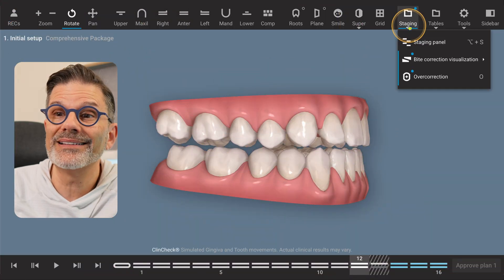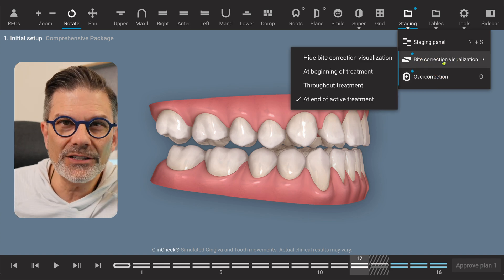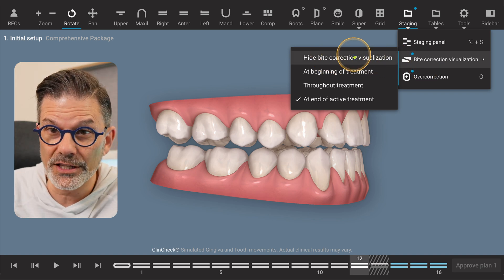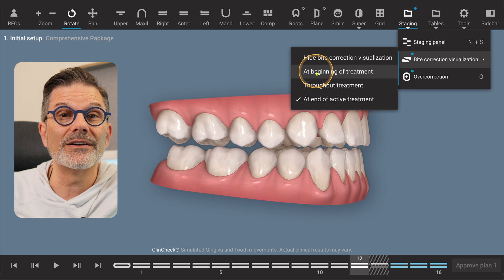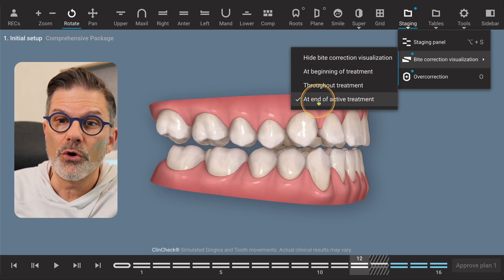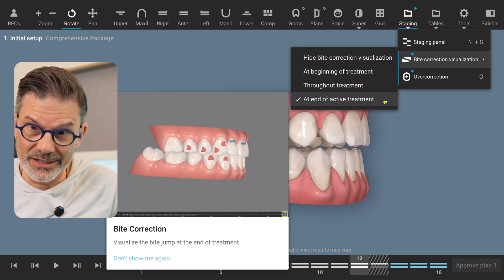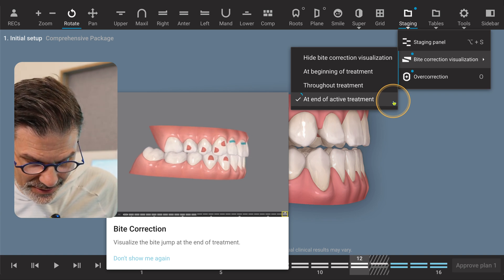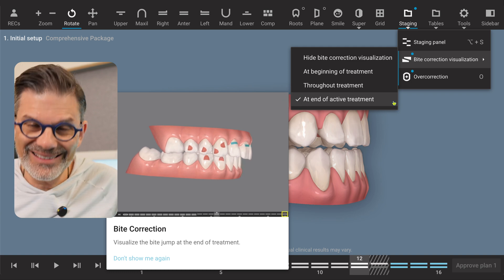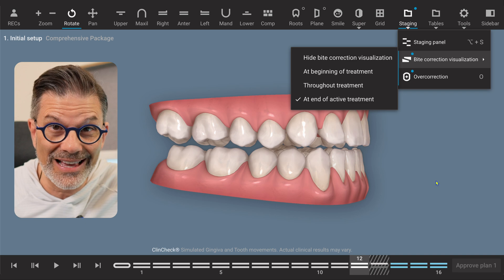There's a tool in the ClinCheck for bite correction visualization. As you can see, when we go on that tool, we have different options. You can hide the bite correction visualization, you can look at the bite correction at the beginning of treatment, throughout the treatment, or at the end of the active treatment. As you can see, with the little check mark, this is what was chosen. So depending on what you choose, you will see different scenarios happening.